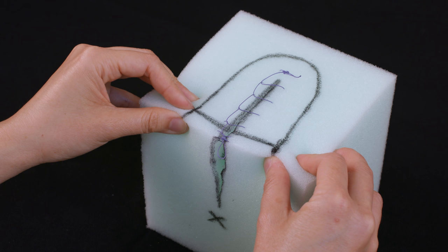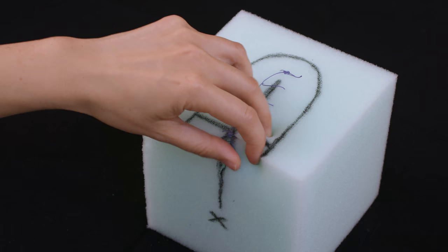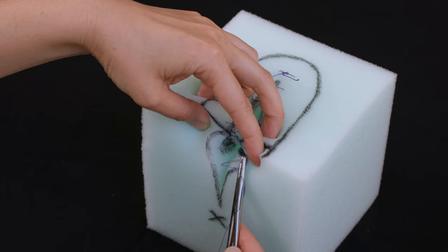After completing the vaginal layer, we will close the deep layers using interrupted sutures. First, place the crown stitch. This re-approximates the bulbocavernosis muscle and rebuilds the perineal body.